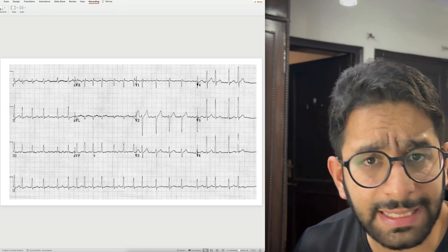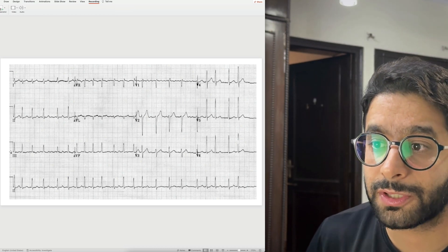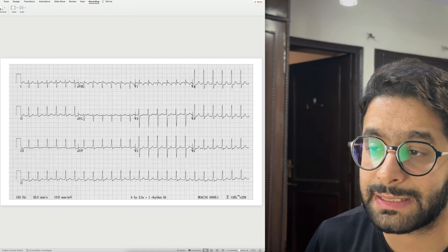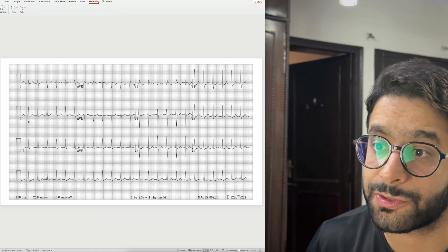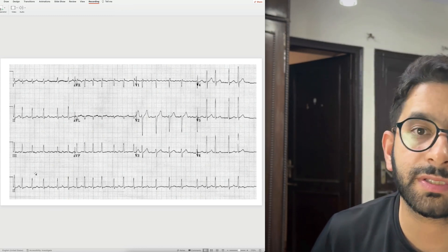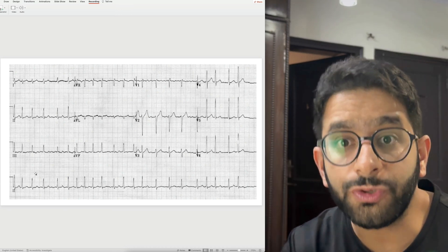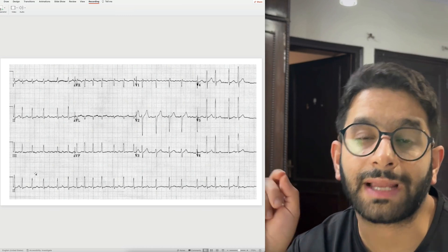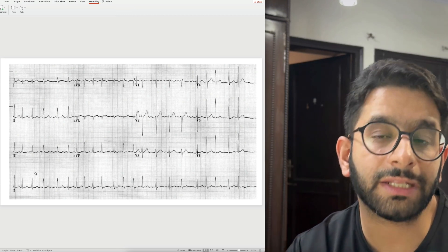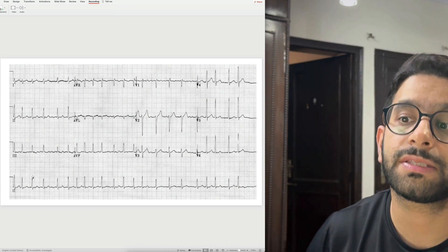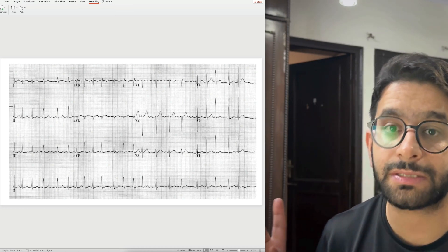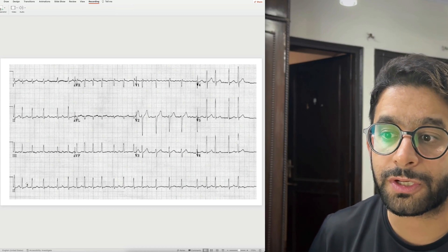This next ECG is again a narrow complex tachycardia, but look at the difference: this one is irregular. You also have a very hard time finding P waves — no regular P waves are visible. This is an irregularly irregular narrow complex tachycardia with no identifiable P waves — this is atrial fibrillation. It is important to recognize because patients with risk factors like hypertension, diabetes, and old age with this ECG are at risk of stroke. Recognizing it and starting optimal anticoagulation can prevent stroke. Atrial fibrillation is the most common arrhythmia in adults.